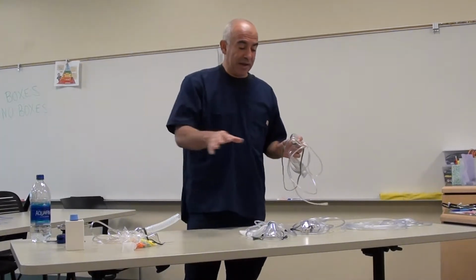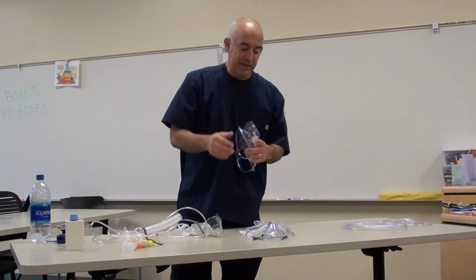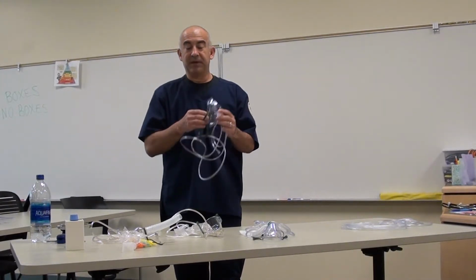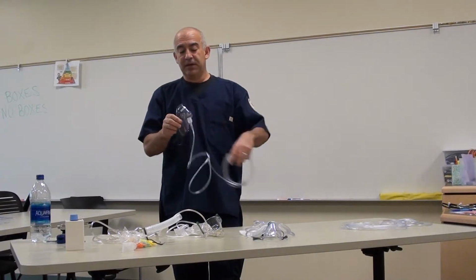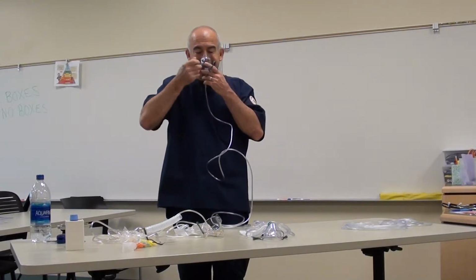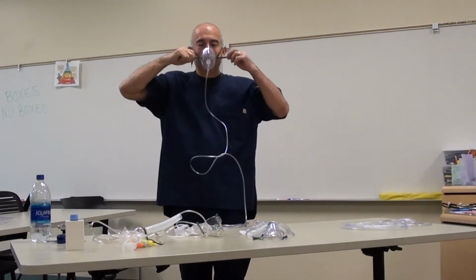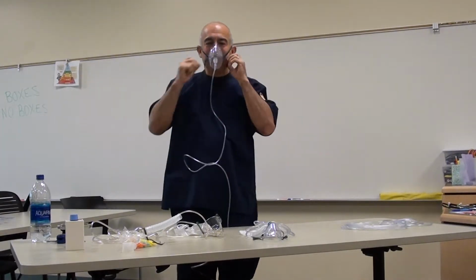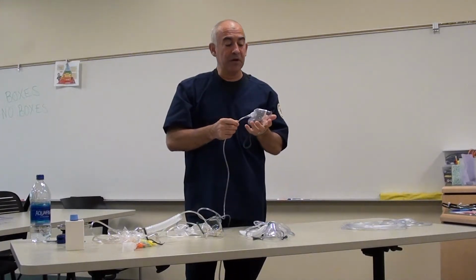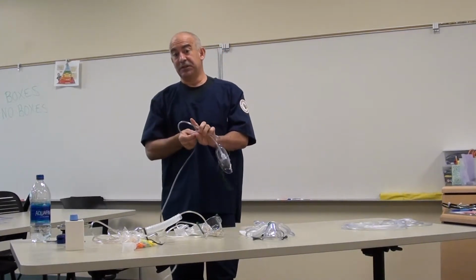So let me show you how to put all these masks on. The Simple Mask, basically you would just plug this into your oxygen device, set your liter flow, and place it over the patient's mouth. This one I'm actually going to put on for you and show how it's done. You'd put the mask over the patient's nose and mouth, pull the strap over their head, and secure it tightly with the straps on the side, and use the nasal clip. You can use the nasal clip to tighten it up against the nose, and you get a nice good seal, therefore ensuring a better delivery of supplemental oxygen to the patient.